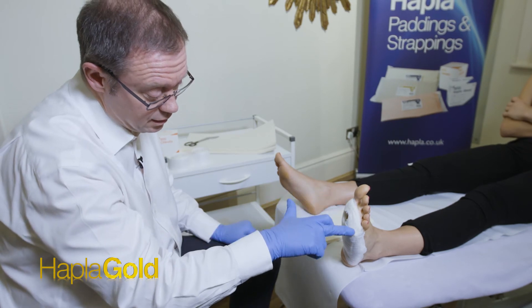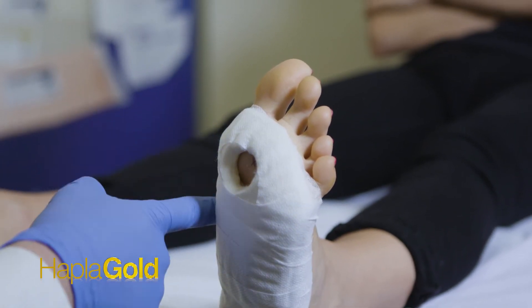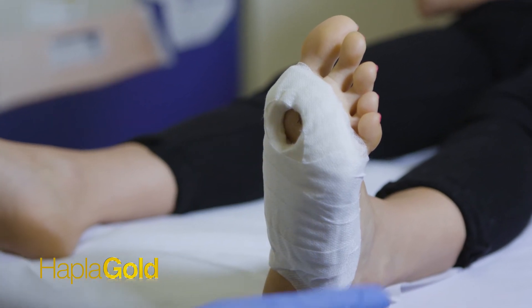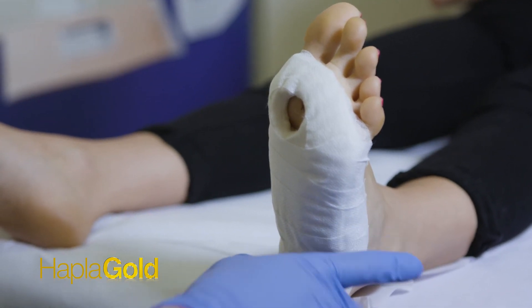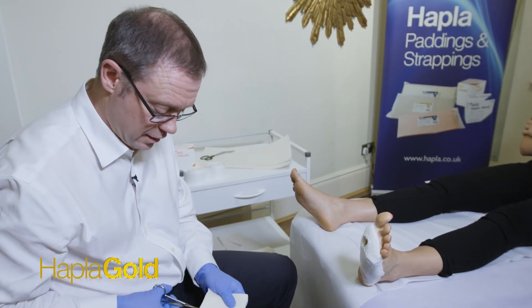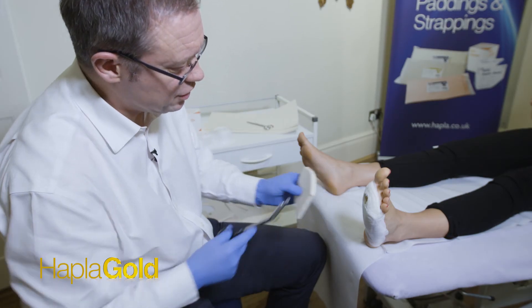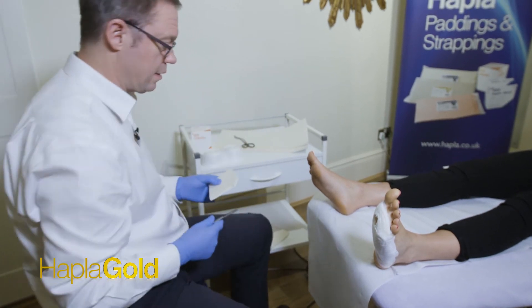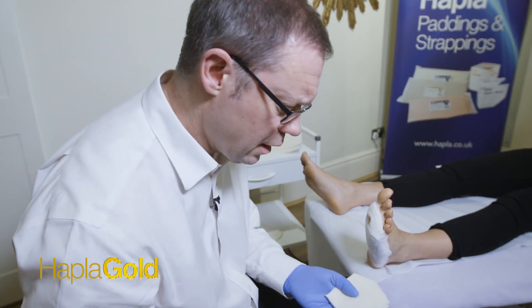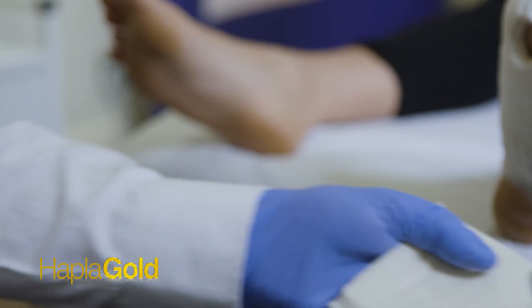The final piece we're going to put on is a plantar cover, which will cover the distal area, down the sides, but will end approximately at the levels of the tuberosity, the navicular and the styloid process, giving a further offloading layer to our 3D system. So we cut that out, and we'll also place an aperture in the same area as the previous aperture. First we cut our beveling all around again, starting with a 45 degree bevel then finishing with a pie crust.